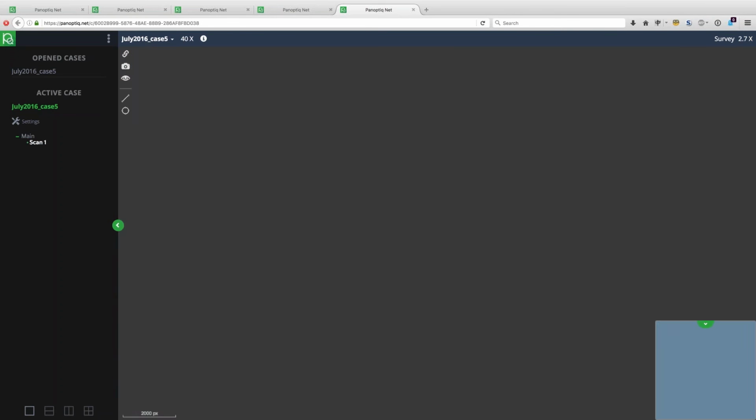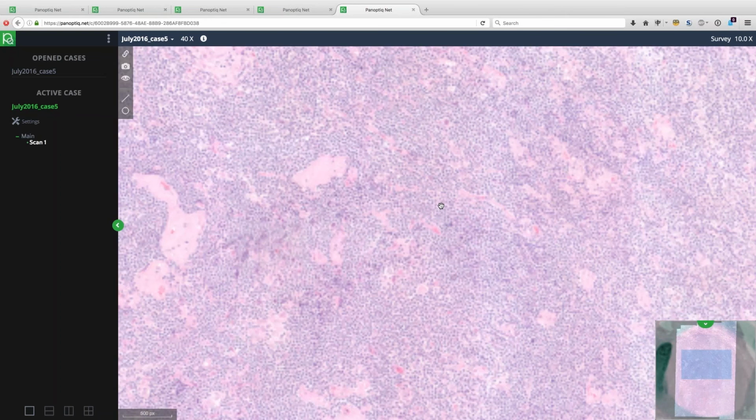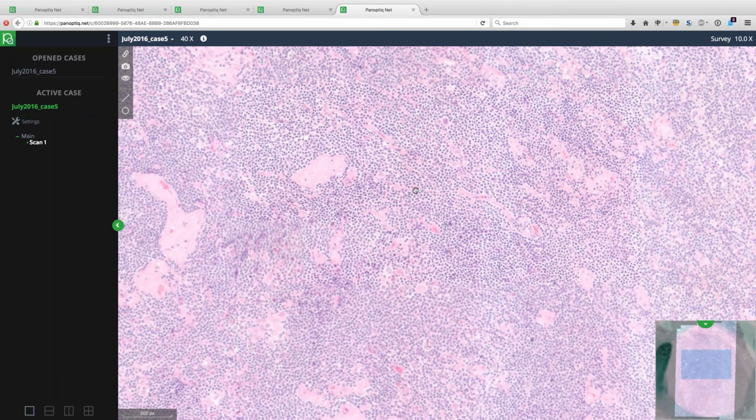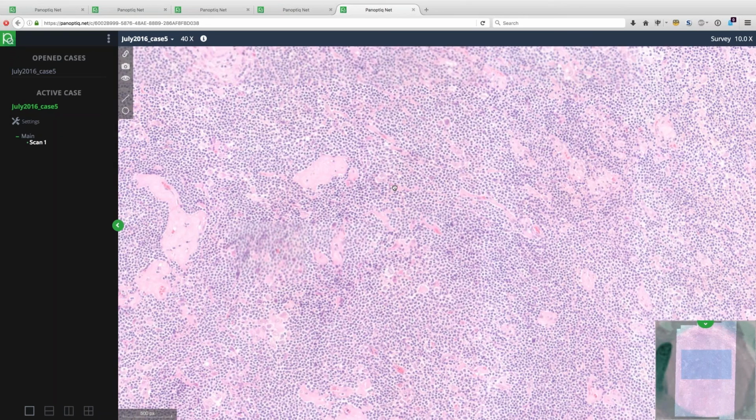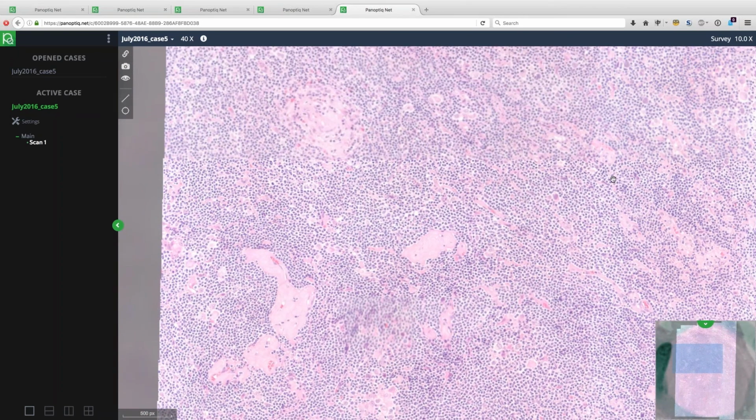So in these cases, unless you were able to go up one more magnification, wonderful, and acknowledge these nodular areas, you'd be hard-pressed to give the right diagnosis. So the differential in this case, of course, is a diffuse large B-cell lymphoma, a much more common lesion with the same immunoprofile and almost similar morphology.